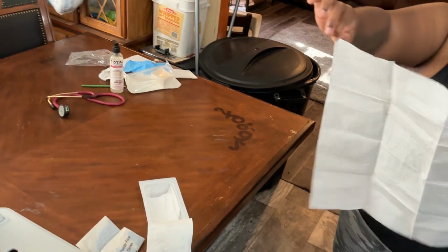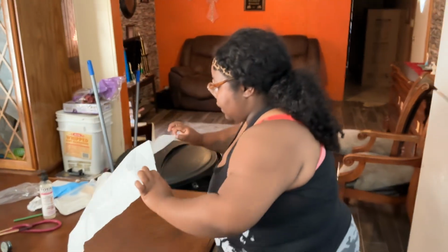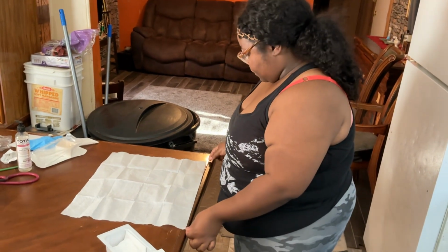I do have a shiny side and a dull side. So this is my shiny side here. I'm going to place it down and maintain sterility while doing it.